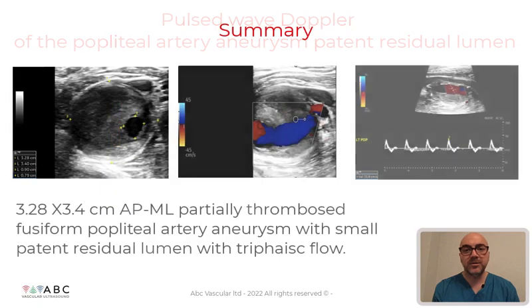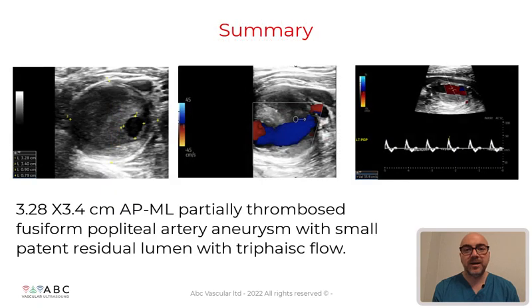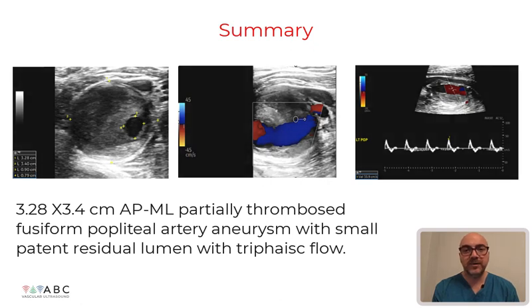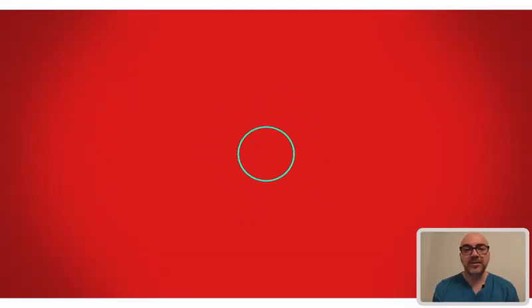In conclusion, we have identified a large fusiform aneurysm of the popliteal artery which is partially thrombosed and presents a small patent residual lumen with triphasic flow. Thanks for joining ABC Vascular Ultrasound.